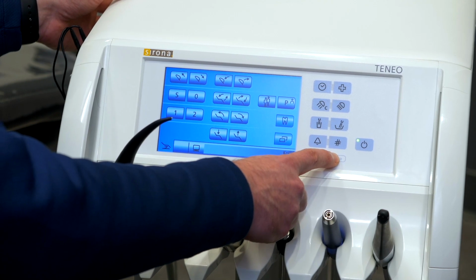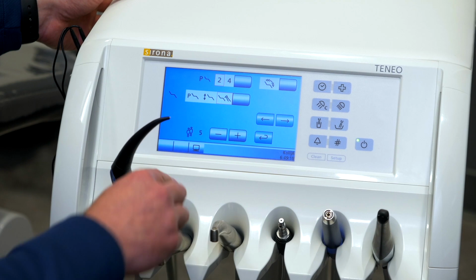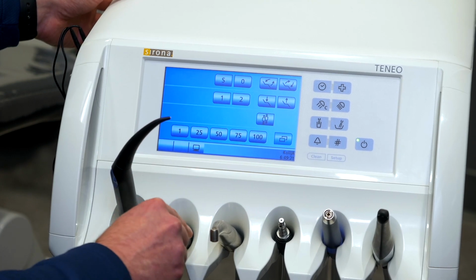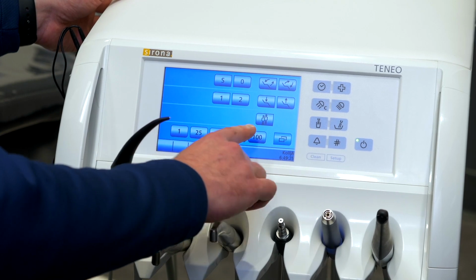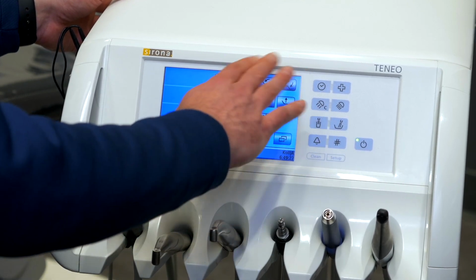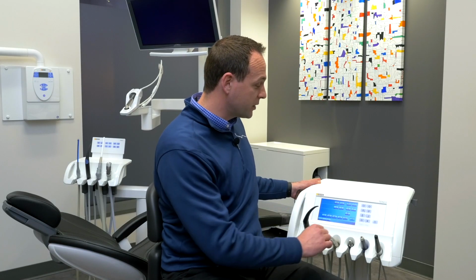We go back into the setup menu, and I'll show you simple mode. And to activate simple mode, go back to my home screen, and this has both my instrument controls, S0, 1, 2, and basic chair movements available here. This is the easiest way without having to dive into separate menus to activate your user interface.